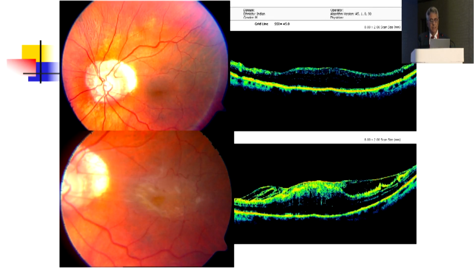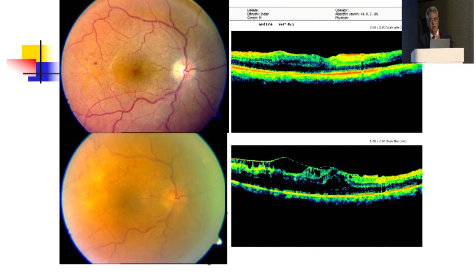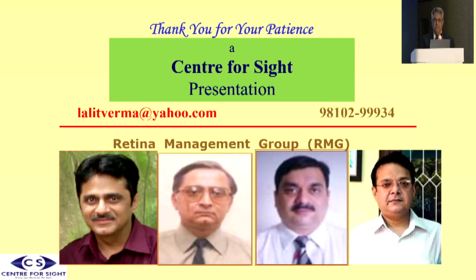These are a couple of results of patients, an obvious grade 3, grade 4 macular pucker here, and the improved picture, on OCT as well as symptomatology also. Most of them, we do a combined cataract surgery as well as macular surgery, because we don't want to give credit to the cataract surgeon always. Some credit should come to the retina person also.